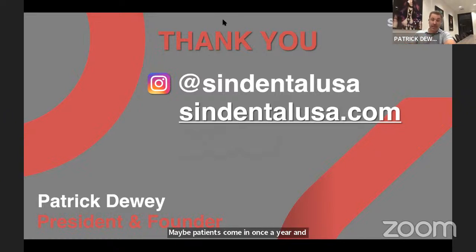But yeah, today, in most of our cases, we do 3 restorations. Day of surgery print costs us $12. After the soft tissue inflammation has come down, we rescan, adapt that to the design, print off 1 more. And if everything looks good on that restoration, we just duplicate that in zirconia, and then we're done.